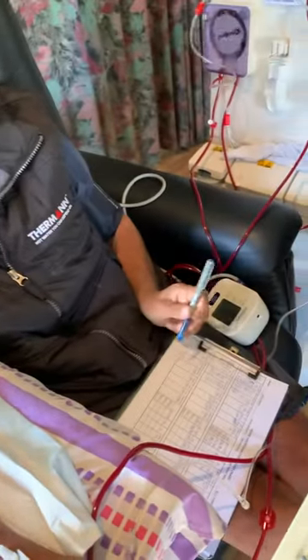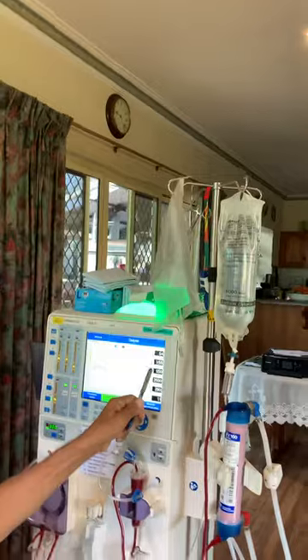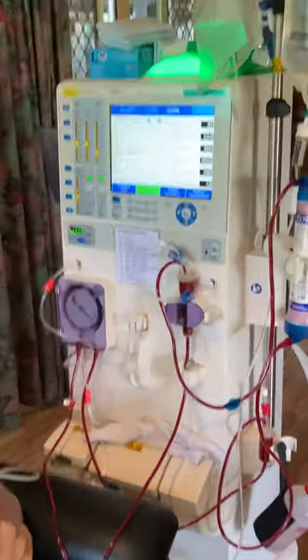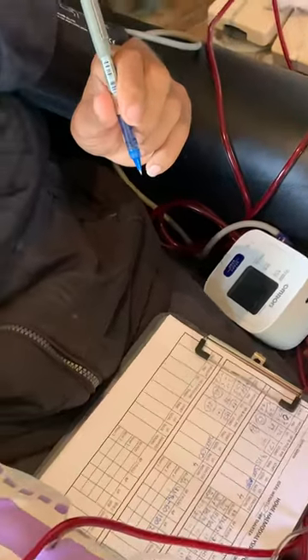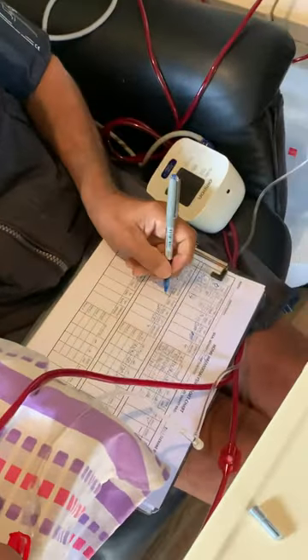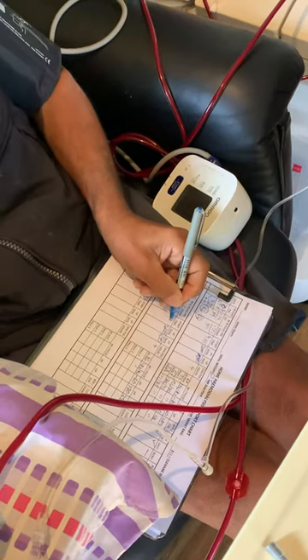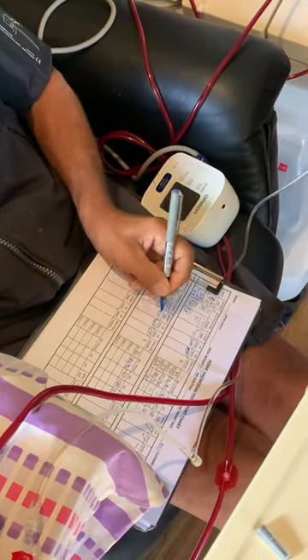How many hours do you do it for? Four hours. And now I've just got to do starting time, which is five minutes ago, which is 9:15.